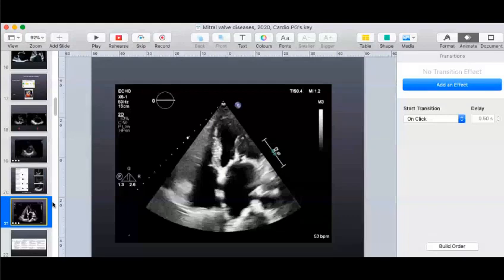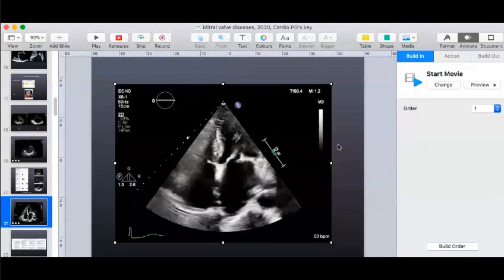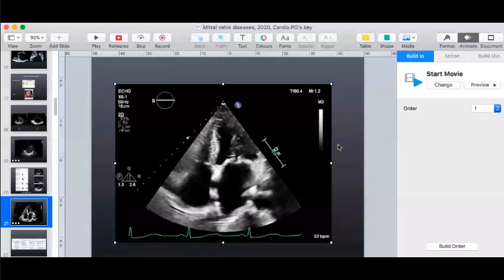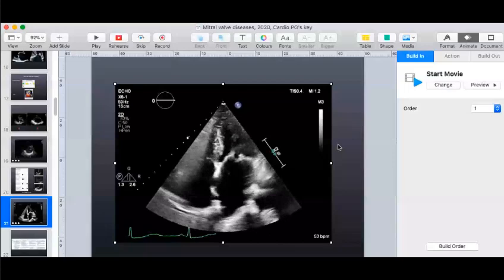Right. Okay. So now, you have this image. Give me your observations. What do you see in this image? This is not a bad image. This is not a good image. It's an average image. And these are the ones which you can leave.